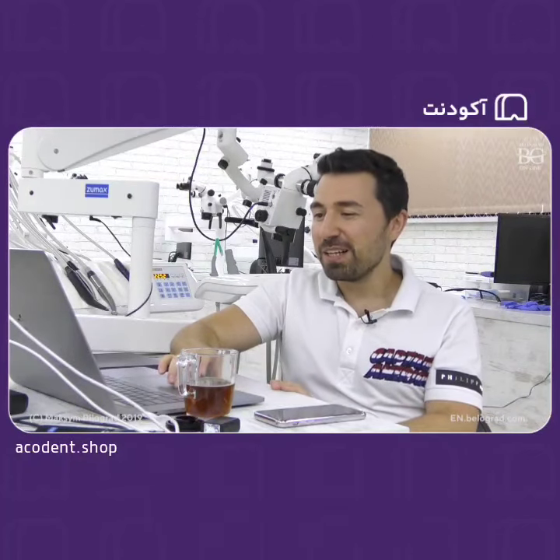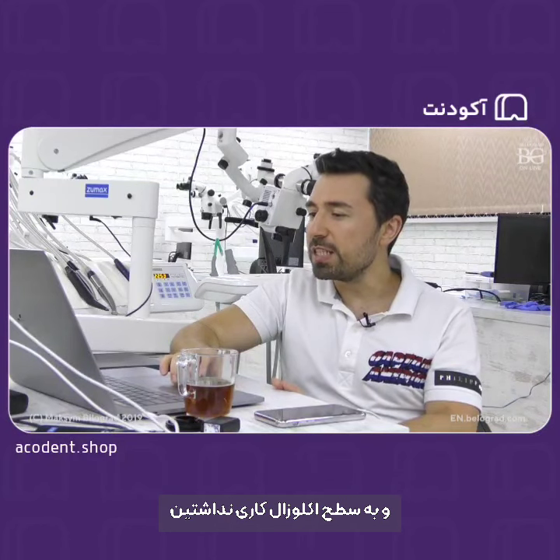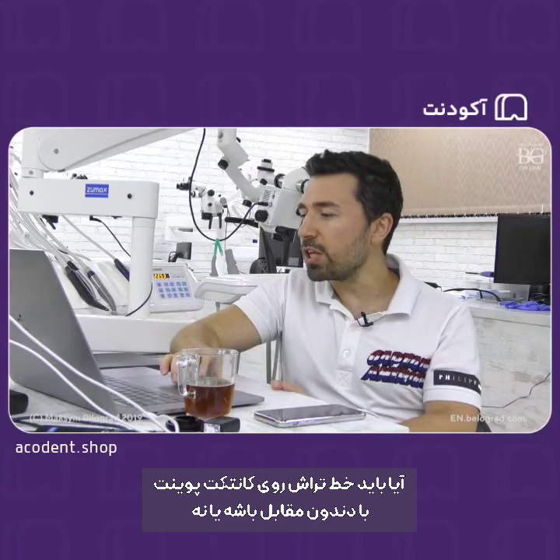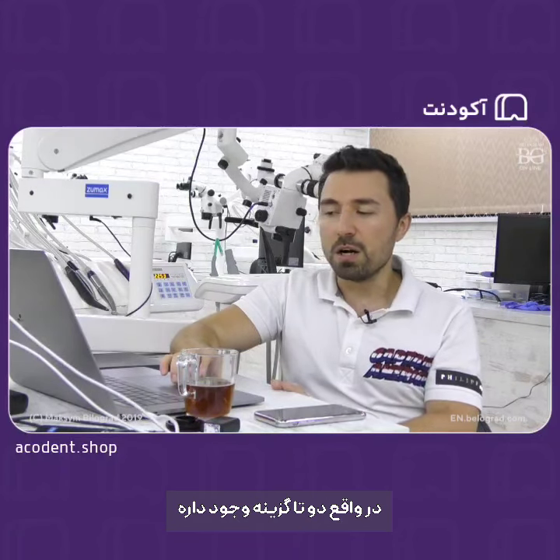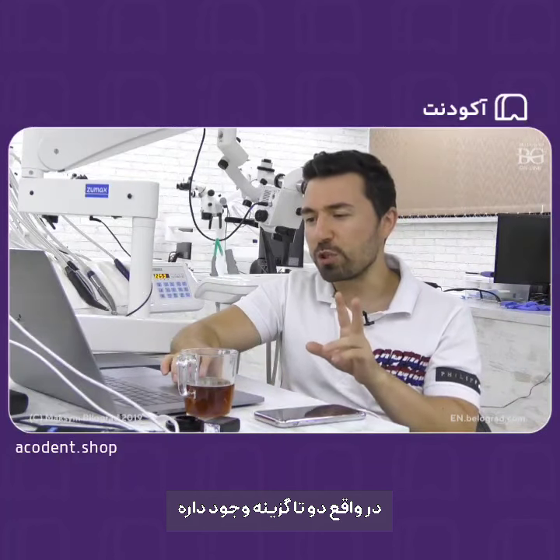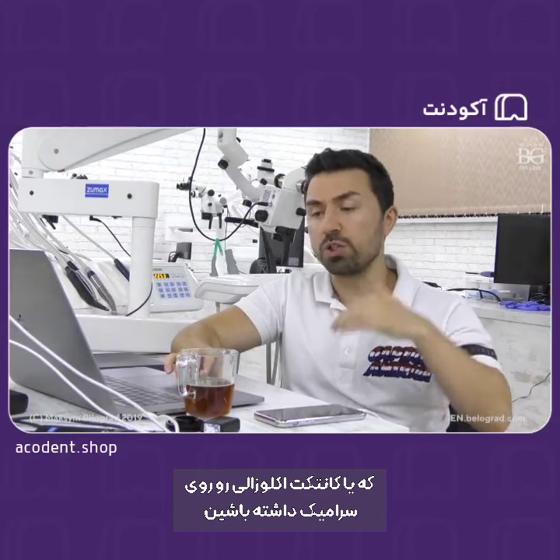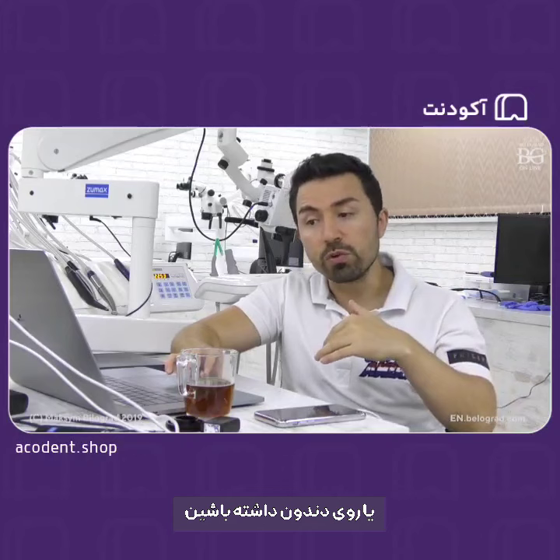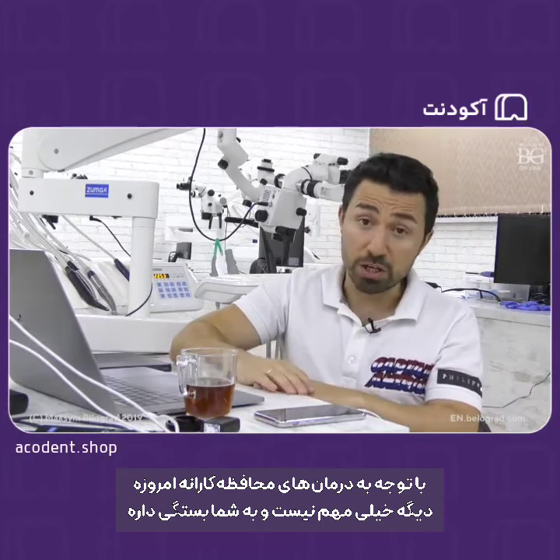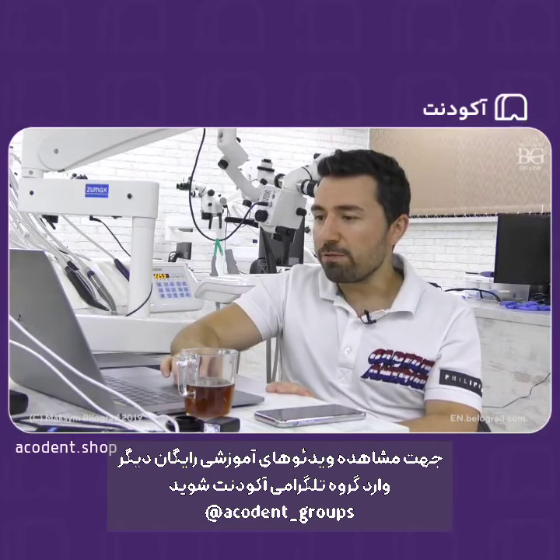When you prepare only the cusps on premolars without the occlusal surface, must the preparation line be on the contact point with the antagonist or not? It depends. Classically there are two options: to keep the occlusal contact on ceramic, or to keep it on tooth. According to conservative treatments, it doesn't matter nowadays. So it's up to you, my friends.